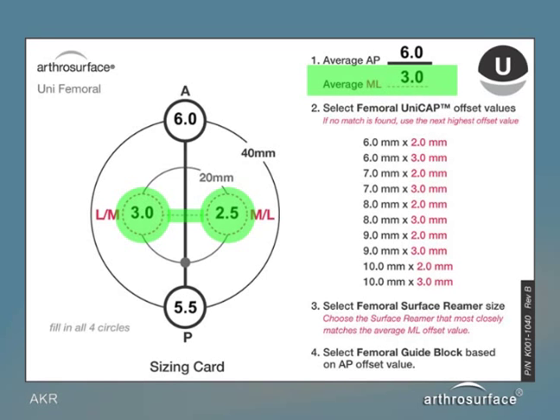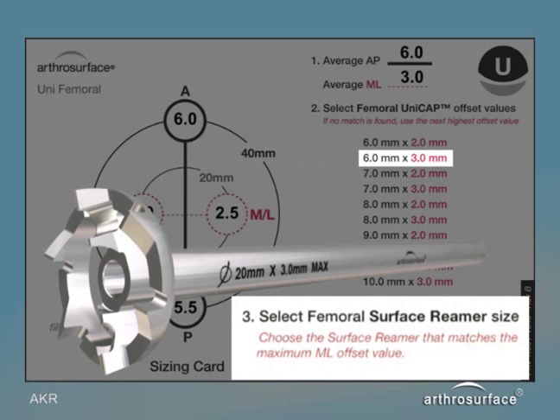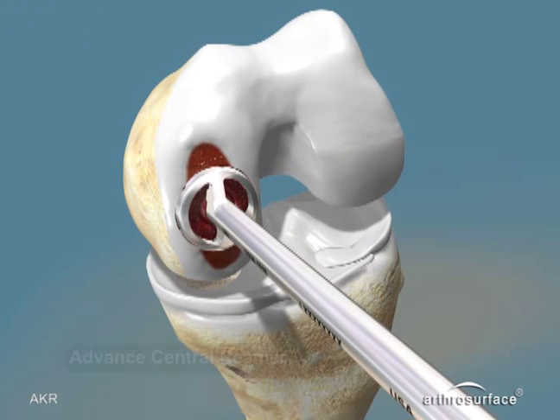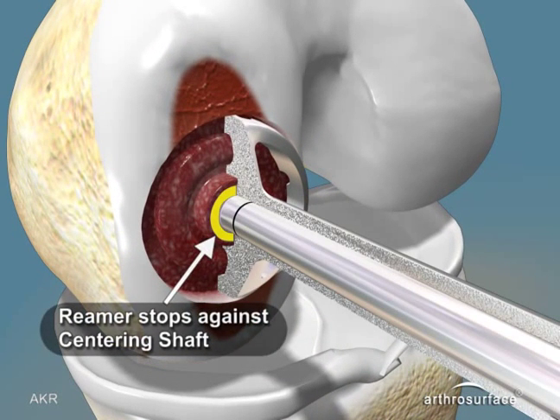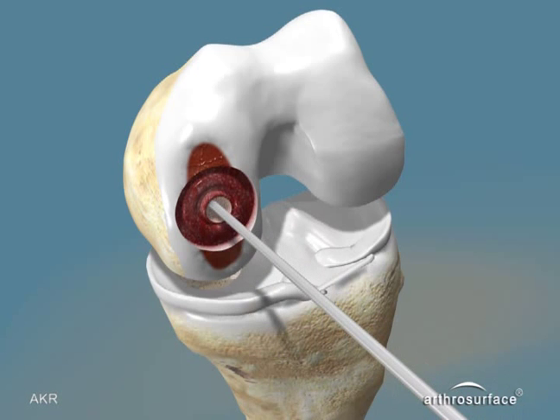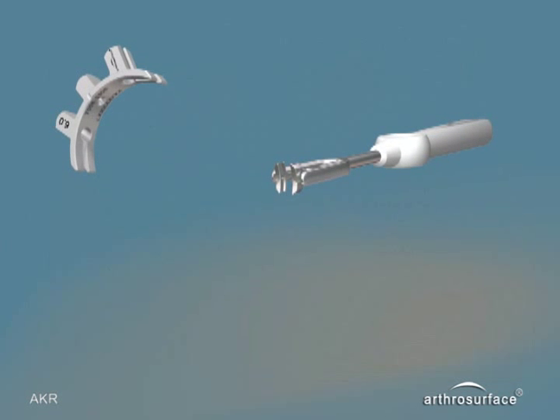If in between sizes, round to the larger size. The femoral surface reamer is selected based on the medial-lateral value — in this case a 3.0 millimeter reamer. Ream over the centering shaft until the reamer bottoms out or stops on the centering shaft, then remove the centering shaft. Select the proper guide block based on the mapping point selected from the anterior-posterior curvature — in this case a 6.0 millimeter guide block.